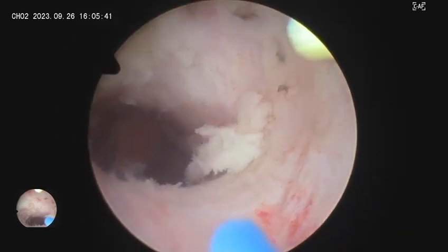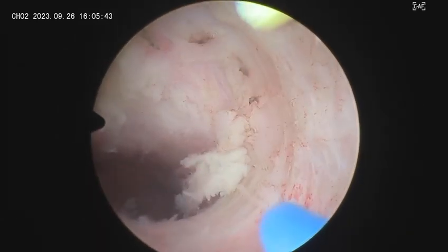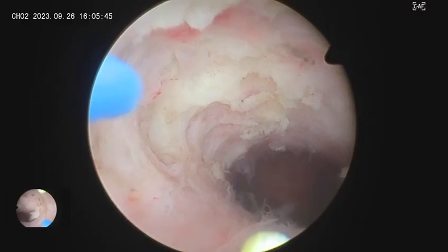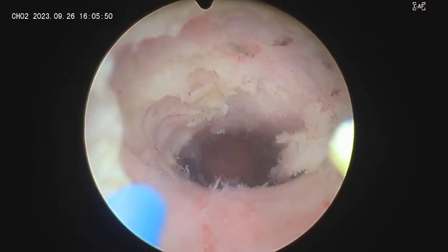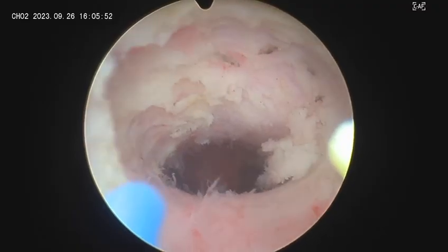epithelialized tissue. Now this will be followed up with HRT for a cycle or 2 so that the epithelium covers over this area yet again.